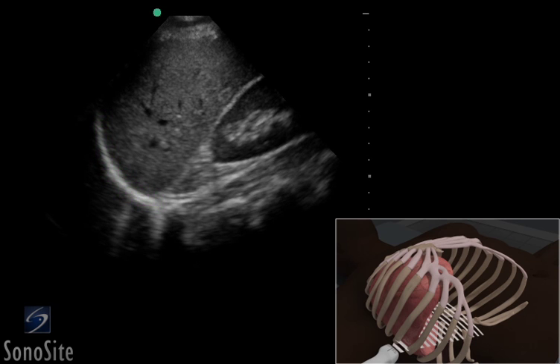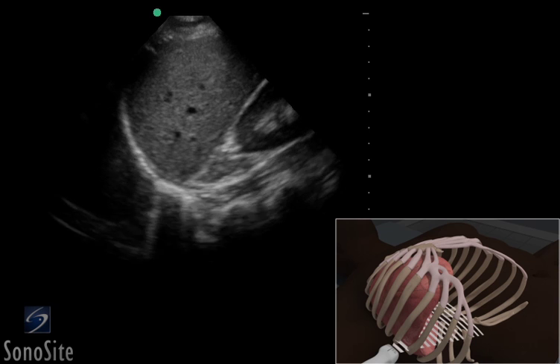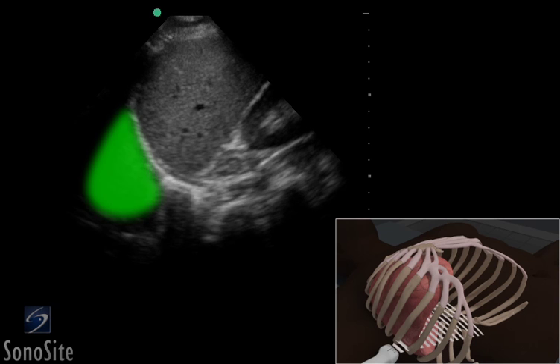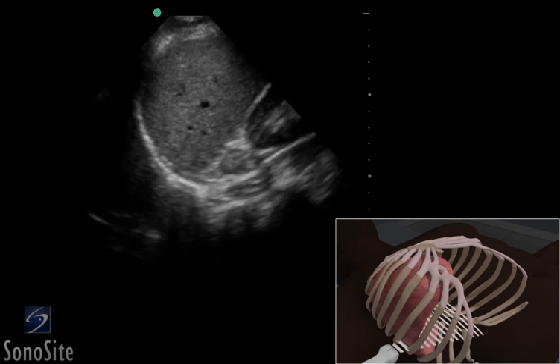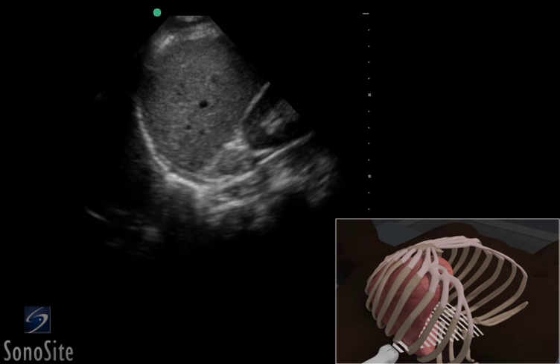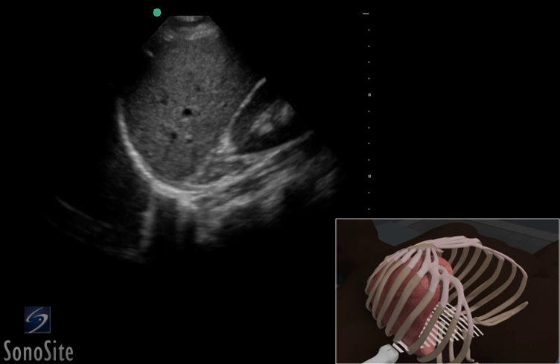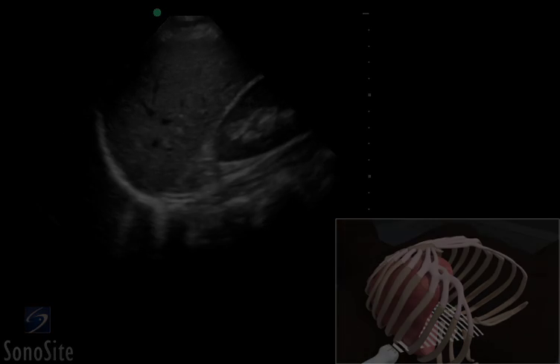In a normal patient, a mirror image artifact of the liver or spleen will appear above the diaphragm.